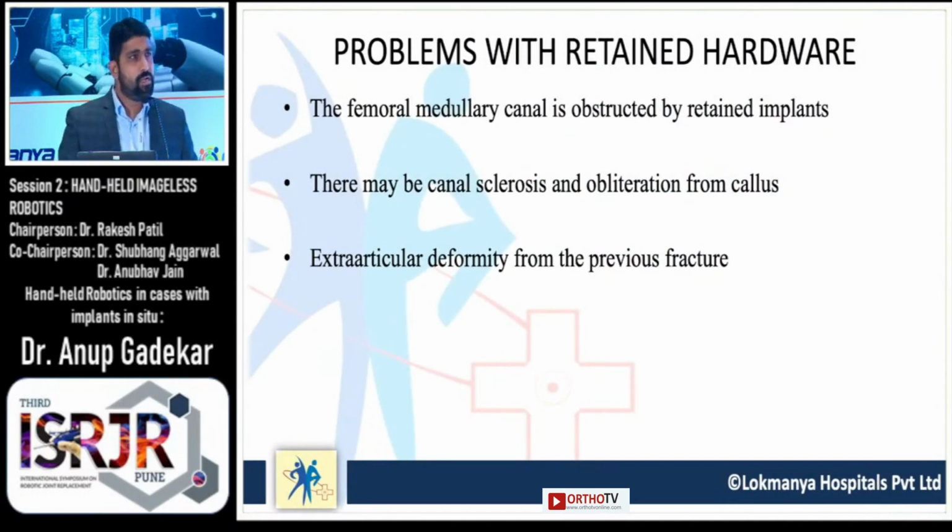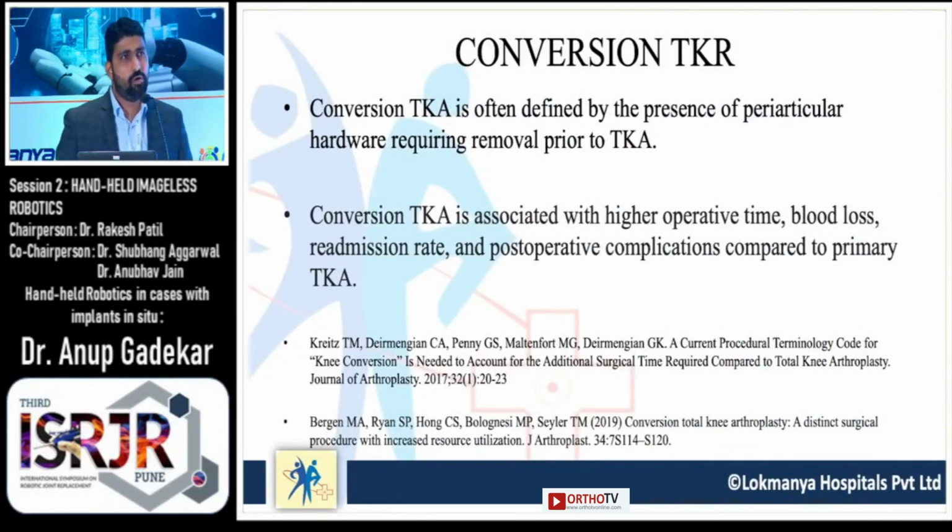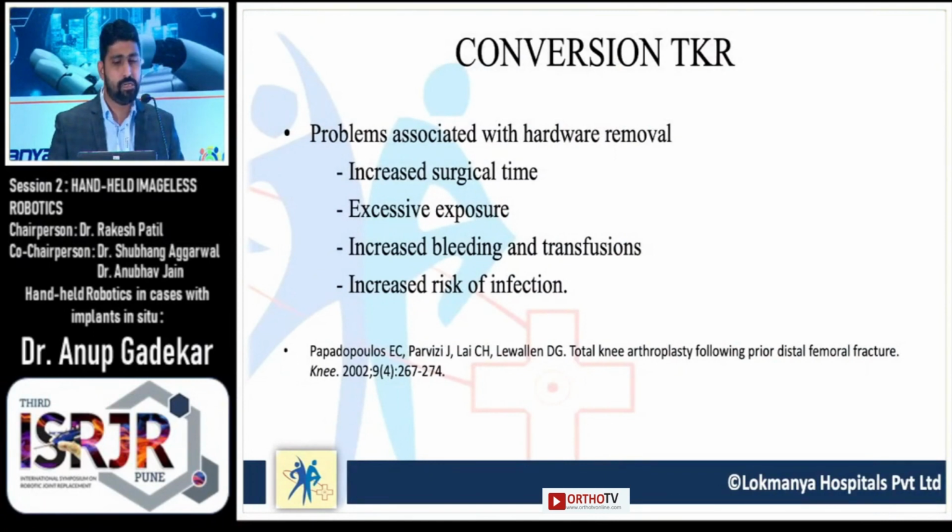Now, what are the problems we encounter with retained hardware? Generally, the femoral medullary canal is obstructed by the retained implants, and there is canal sclerosis and obliteration from callus. Also, sometimes there is extra-articular deformity from previous fractures. There is a term coined, conversion TKR, in which periarticular hardware removal is required prior to TKR. In the literature, conversion TKR is associated with higher operative time, blood loss, readmission rate, and post-operative complications compared to primary TKA. There is another paper by Parviz et al. where he has mentioned the same problems with hardware removal.